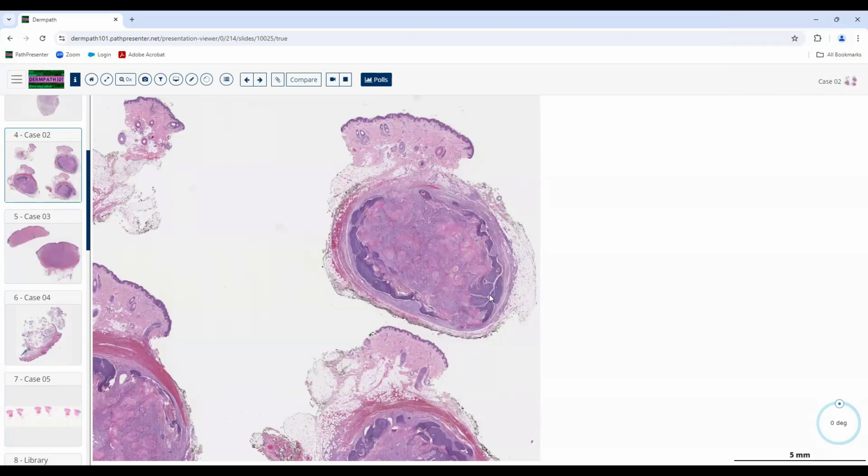So you think this one, as opposed to the last one, is epithelial or non-epithelial this time? I would say this one is epithelial. Yes, good. In the last one, we saw what looked like a very pale, diffuse process, and at higher magnification we saw spindle cells. At low magnification here, we see cells that have a basophilic quality to them, and then some that have an eosinophilic quality centrally. So these almost look like they're forming some kind of structure here.